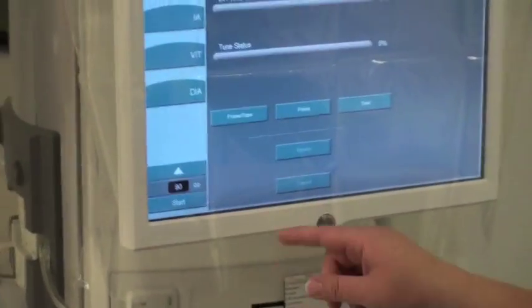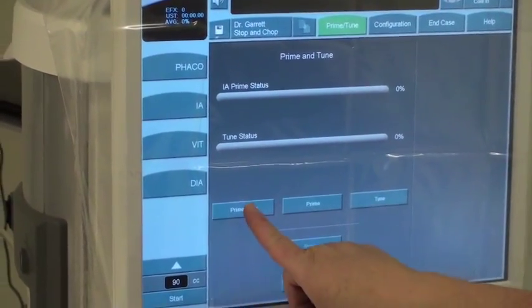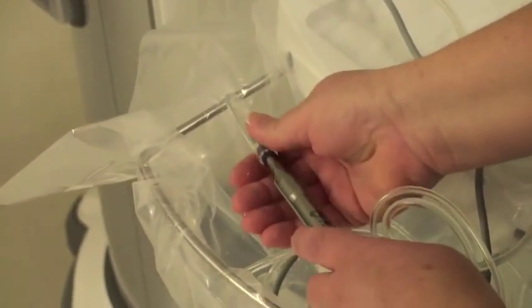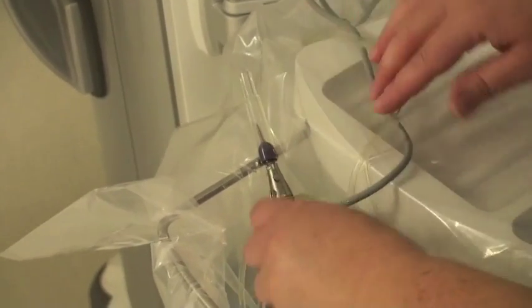Now it's done, so it stopped. You're going to hit prime tube, and you want to have your sleeve ready. Hit prime tube and it's going to start to pour out of there — you want to just fill it up, push it on, and then just place it upright like that.